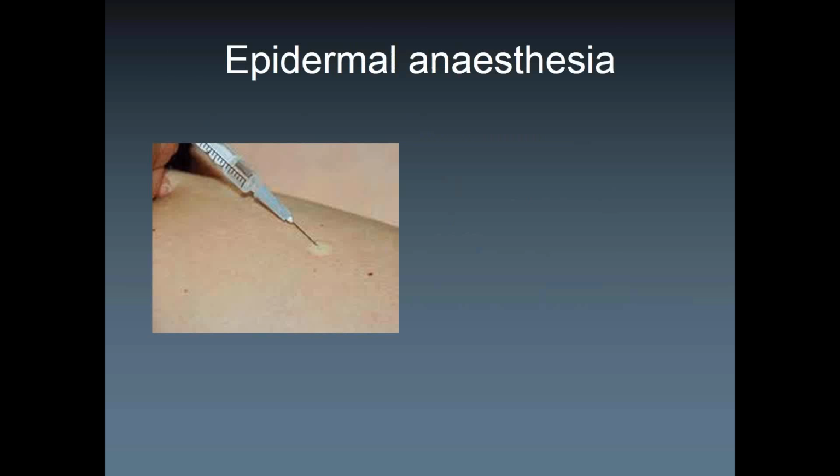And the usual perception is that if you do a very flat approach into the dermal layers, you're going to do the patient a favor, which is mostly or sometimes okay, but still you're going to see patients who have a lot of pain when you do this approach, because many people just go in there too deeply. So what you don't want to do is go in a centimeter and a half and then inject, because you're going to go through non-numbed tissue, right? The better way is to inject even when you're outside the skin, so you see some fluid spilling around, and then keep injecting as you go through the dermis.